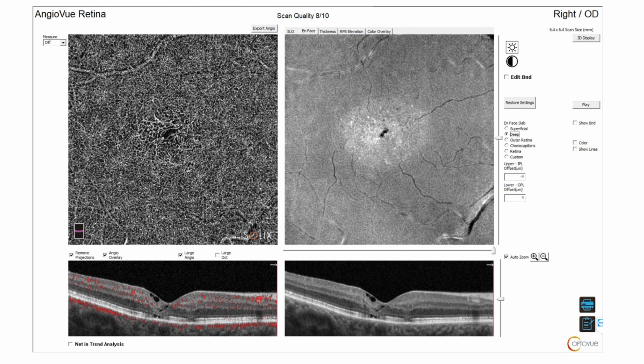You can actually see the anomalous vasculature on OCTA, and it gives you this, again, pathognomonic appearance. So maybe somebody wasn't sure just on OCT, what am I seeing here? Why am I seeing cystic spaces? Why am I seeing what looks like a macular hole? And then you go and you do OCTA, and the OCTA really identifies that this is a vascular abnormality.